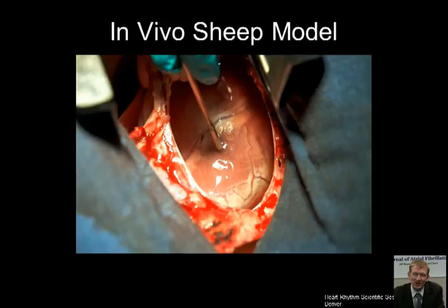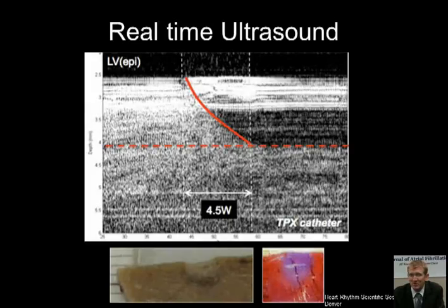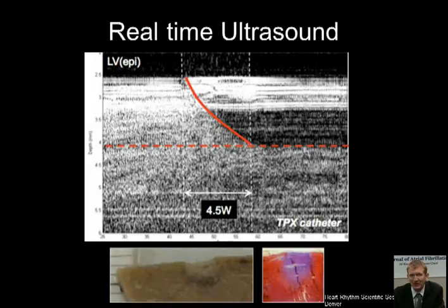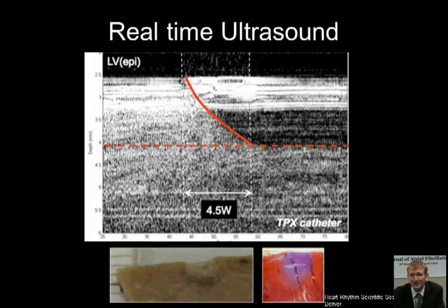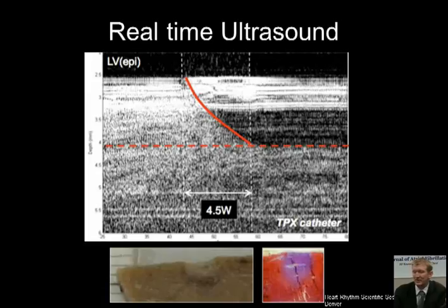Here is an example of the results from the real-time ultrasound. This is an epicardial lesion, and this is the M-mode image. I've put the red line where the lesion starts to develop. The thick white line at the top of the picture is the TPX membrane. If you look at the left-hand side of the image, there is white going throughout the entire trace, whereas towards the right-hand side, there is a change in the ultrasound contrast which demarcates tissue necrosis. When we analysed the pathology, done by four blinded independent observers, there was a very good correlation between the ultrasound change and the changes seen at pathology, especially with the necrotic area but not with the haemorrhagic area.